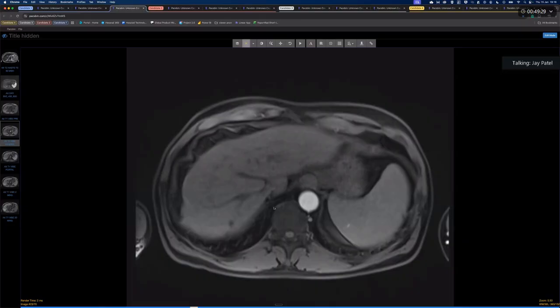And as a result, LIRADS is a fantastic document on HCC in terms of very clearly defining what is and what isn't. And for those of you interested in GI, I'd strongly recommend it as a really great resource just to read and understand liver MR in a great deal of detail.